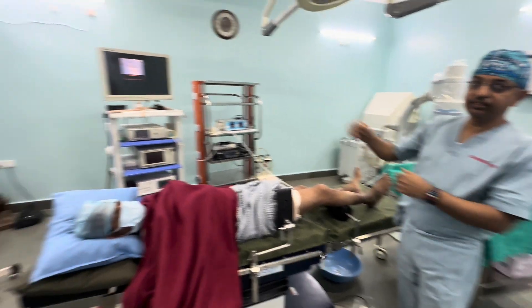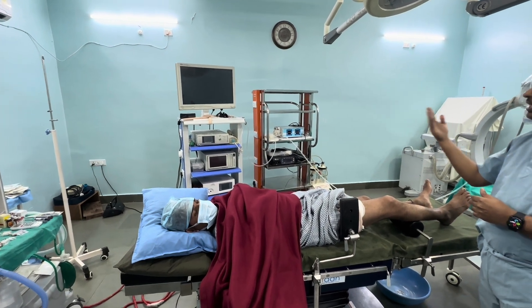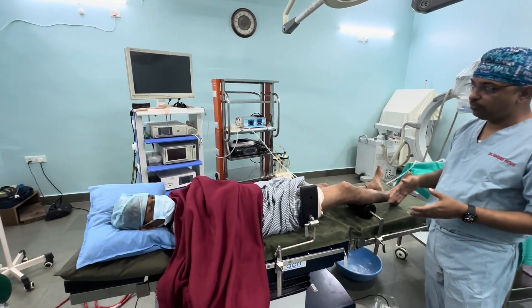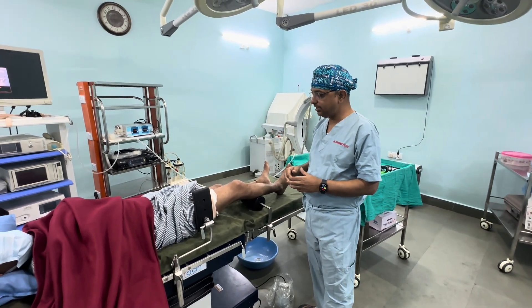All our endovision system and instruments trolley will be on the other side, so when we operate on this side we get adequate vision and dexterity.